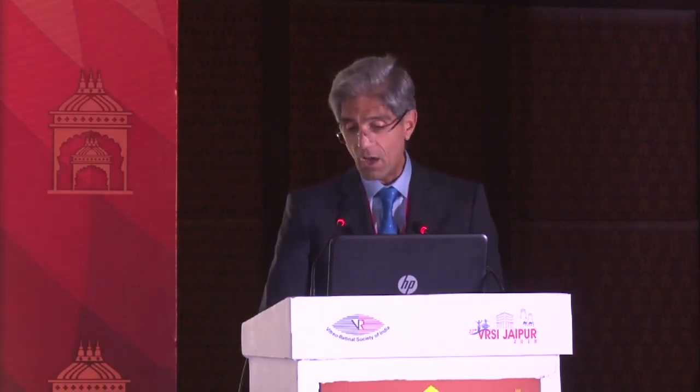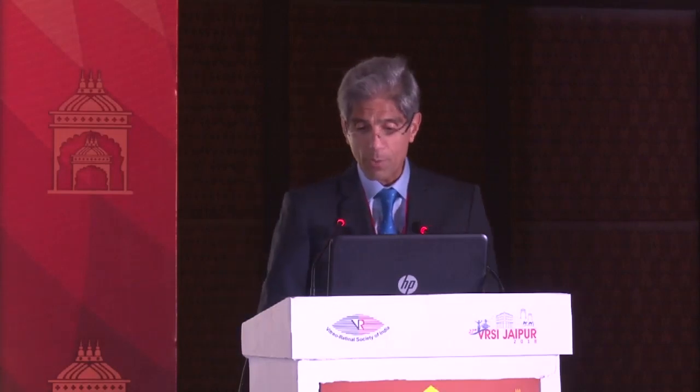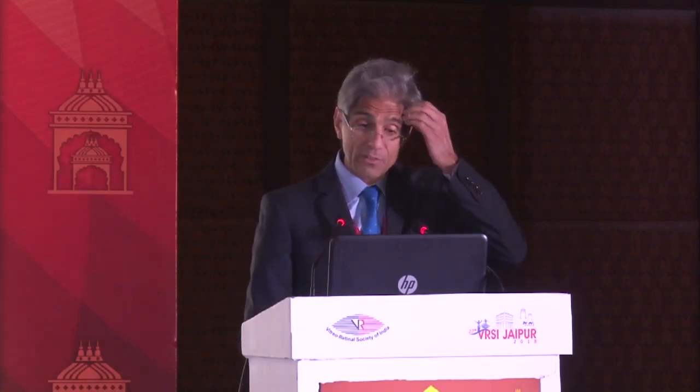This patient with a little bit of a bullseye maculopathy, very advanced. On follow-up, you can see a more obvious cookie-cutter lesion with progression after discontinuation of therapy. Amani Fawzi has indicated that the loss of the ELM can be a biomarker of change, and if the ELM is lost, you're going to see progression of disease, whereas if the ELM is preserved, you can see reconstitution of the ellipsoid with discontinuation of therapy, as you can see in the bottom panel.